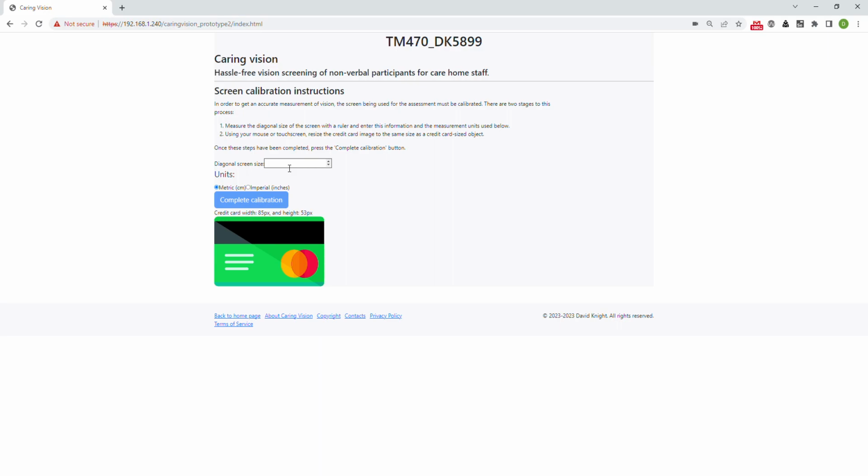So we're going to move on to the screen calibration. So now we know about the camera, the details of the camera. What we don't know is the details about the screen. Now the computer can find out the number of pixels, the height and width of the screen in pixels, but it needs to know the physical screen size. And so that's what this is all about. So this is what we need the tape measure.